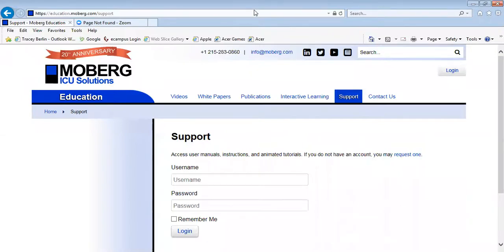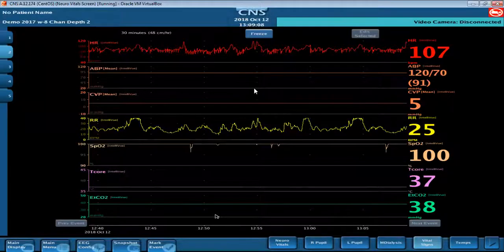And I'm going to go back to the CNS monitor screen now, hopefully. Let's see if that gets us back. Okay.